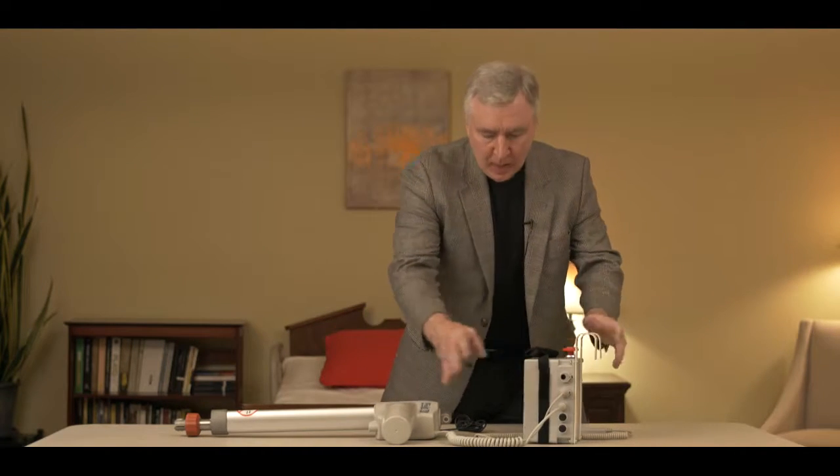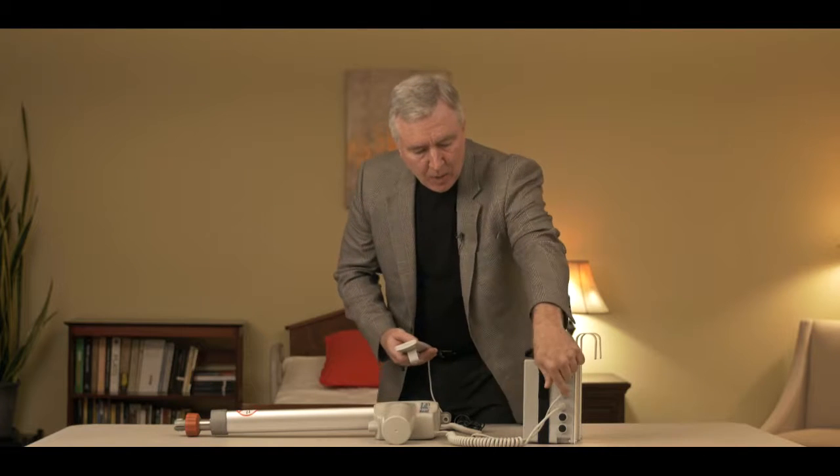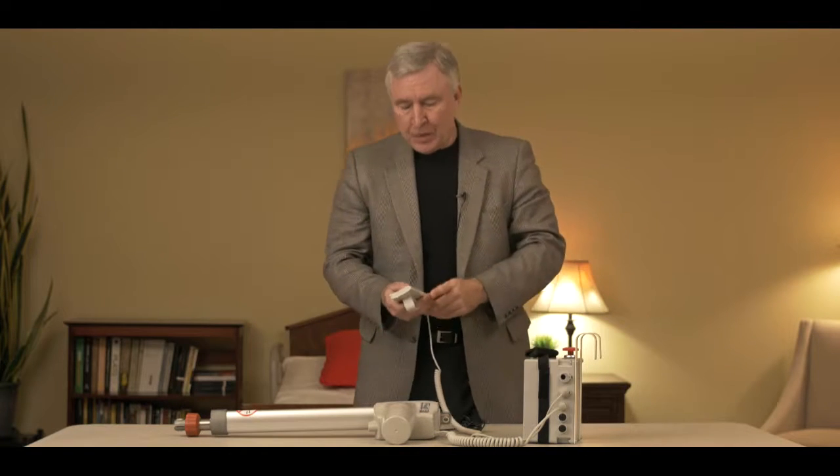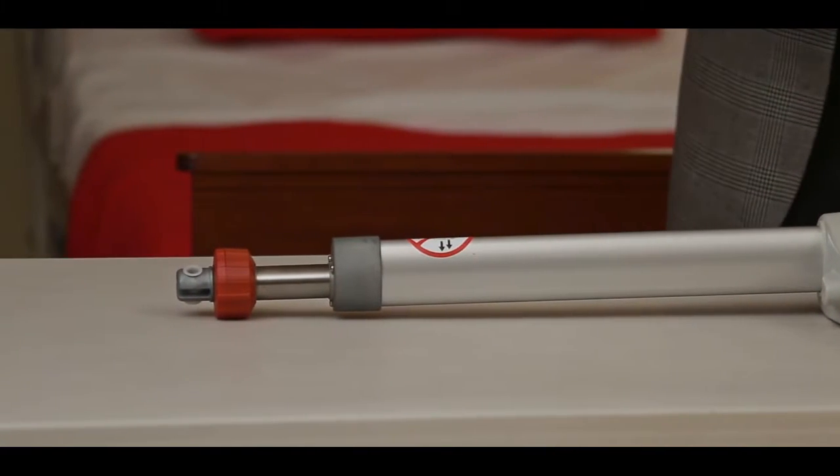Hey folks, Damian here with BestCare. The purpose of this video is to help you troubleshoot your Style 1 electronics. You can see here that we have everything plugged into the system right now so we can run it — to show how this would work when it was on your lift. The control box has the actuator plugged into it, and the hand control. When we hit the up button, you're going to see this motor go up and down, just as if it was on your patient lift.